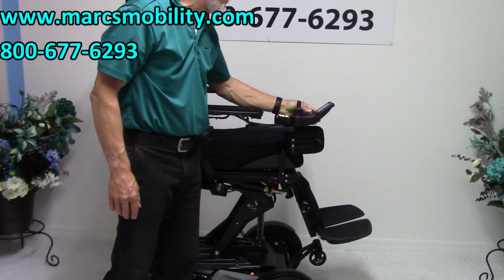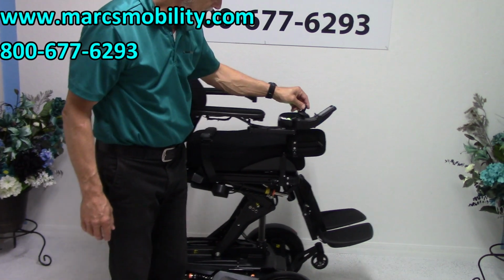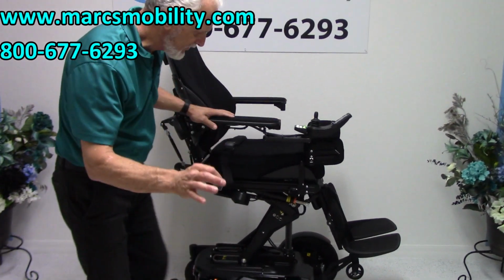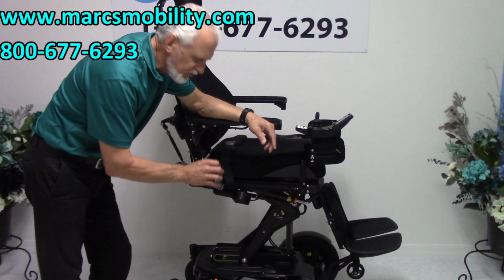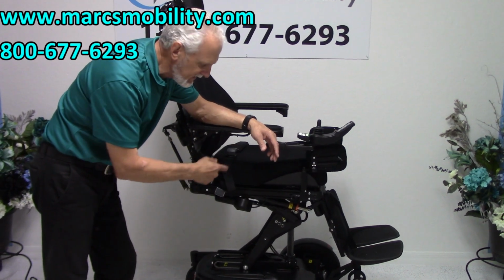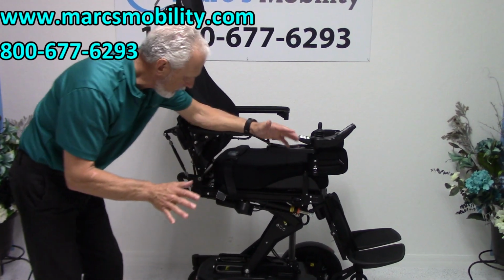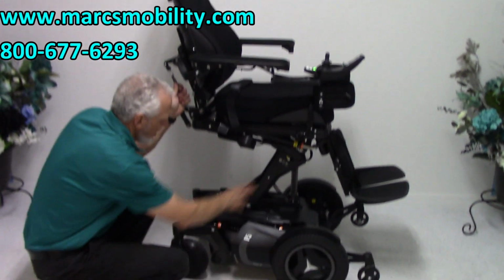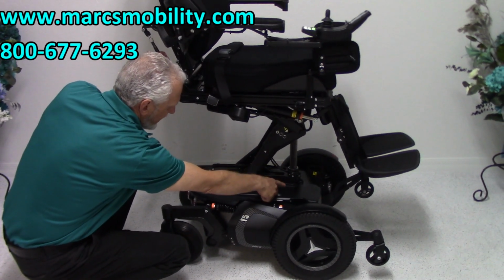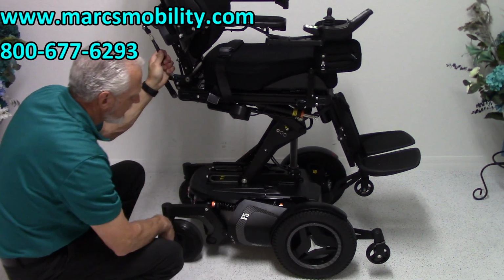Now, if I want to drive the chair, I can still drive the chair with the seat elevated. Make sure if you drive the chair with the seat elevated, that you drive it on flat surface in your home. Do not go outside with the seat elevated. You're just asking for trouble. As you can see, the armature for the seat lift, the actual motor is right here on the front. This is the armature right here.